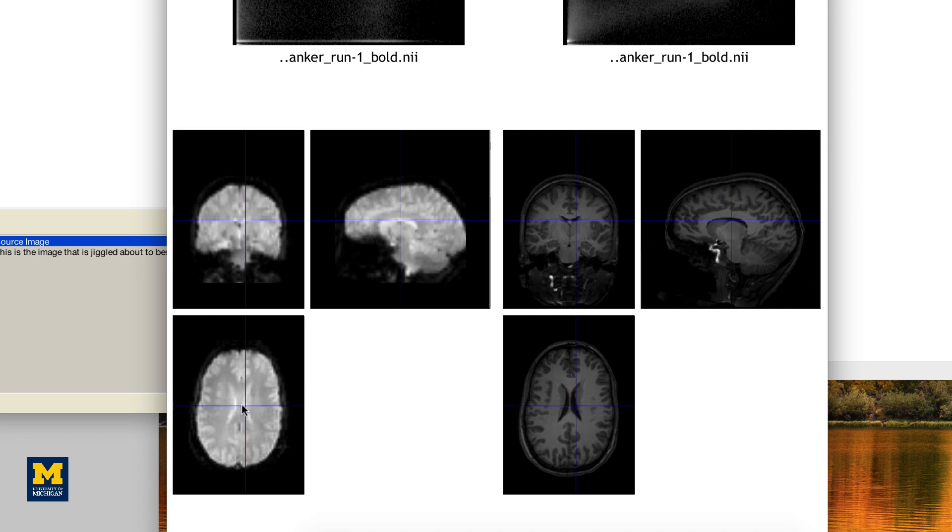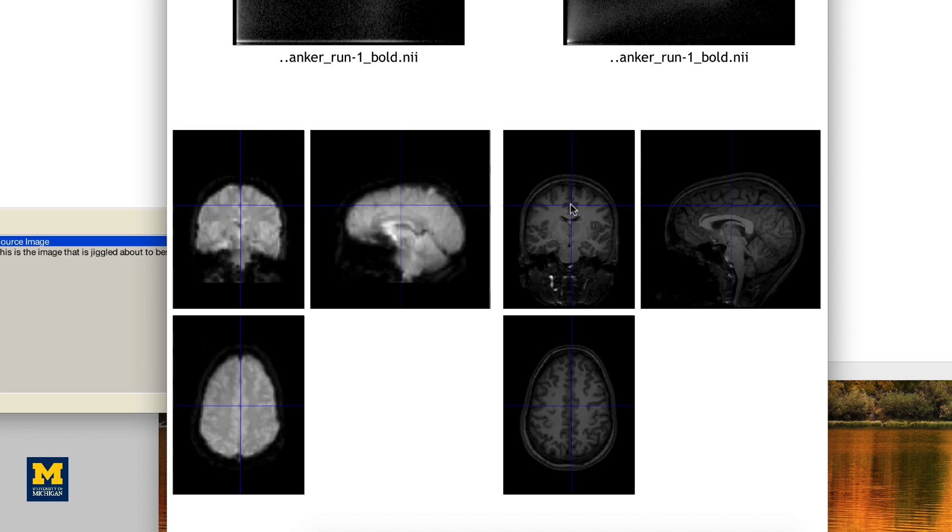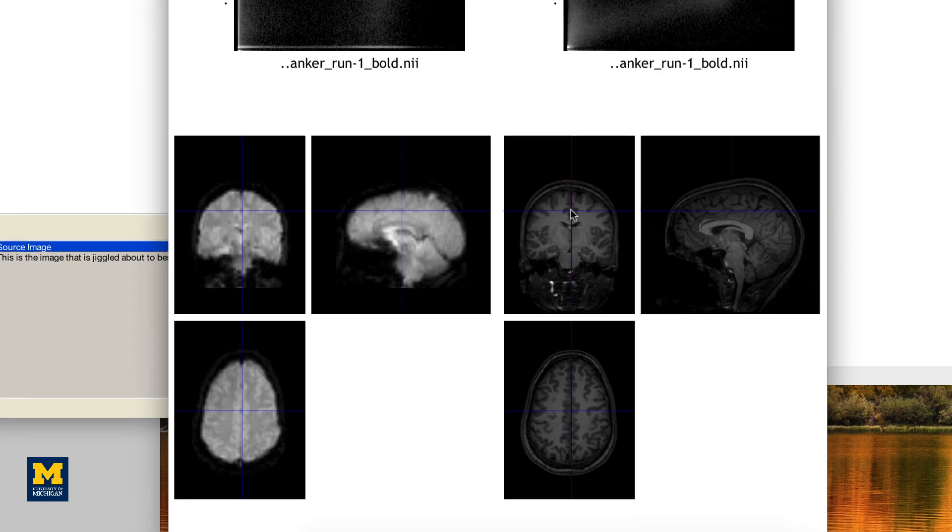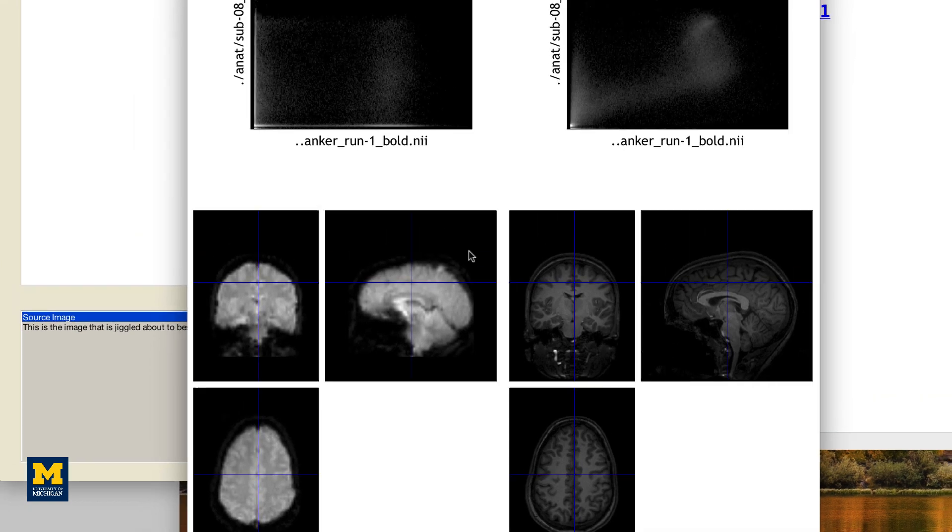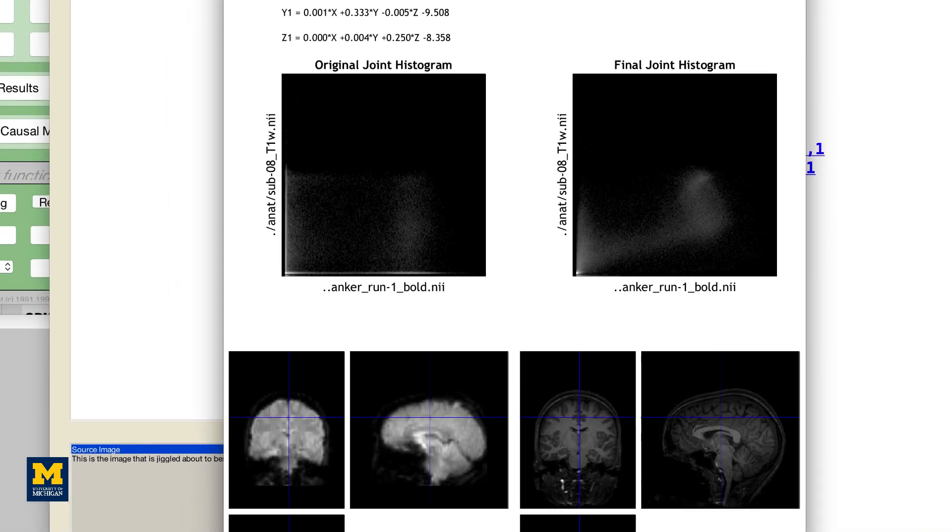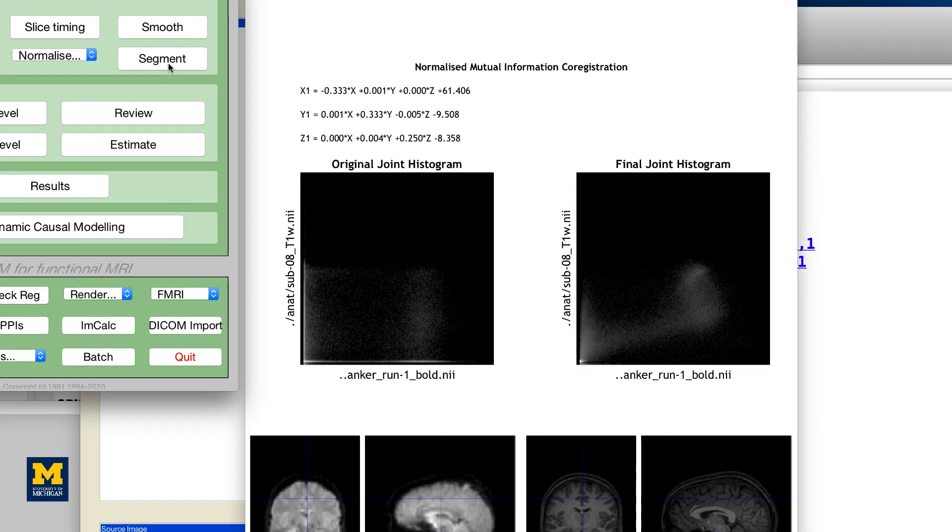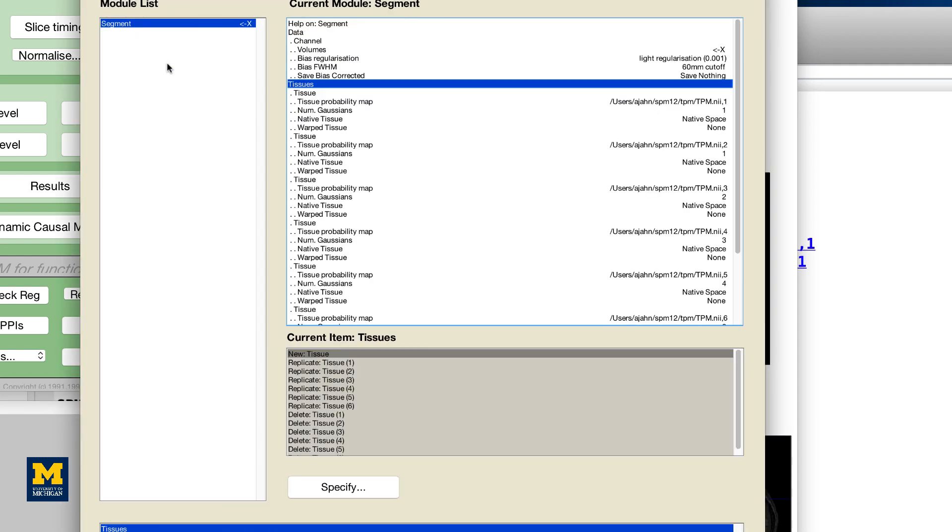Remember that the intensities will be flipped. Darker areas in the anatomical image, such as the ventricles, will appear brighter in the functional image and vice versa. Now that we have co-registered the images, we are ready to normalize all of our data to a standardized space. Before we can do that, however, we need to segment the anatomical image in order to align the different tissue types when we normalize it.